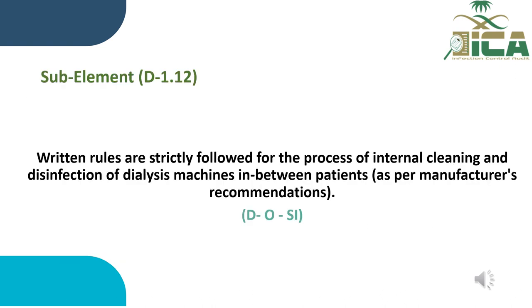Sub-element D1.12. Written rules are strictly followed for the process of internal cleaning and disinfection of dialysis machines in between patients, as per manufacturer's recommendations. This is determined by documents, observation and staff interview.